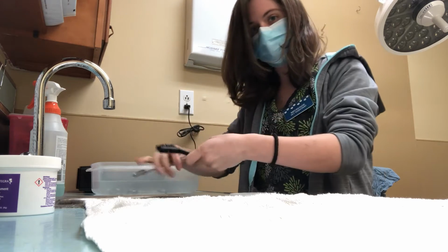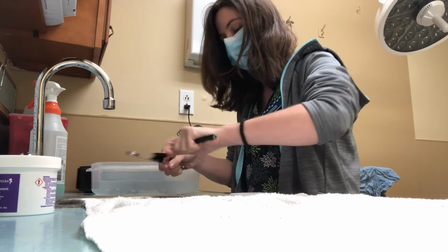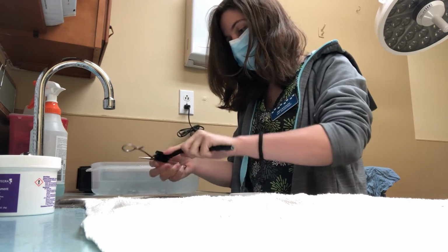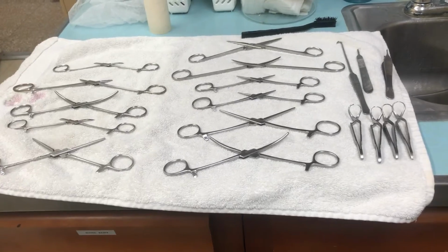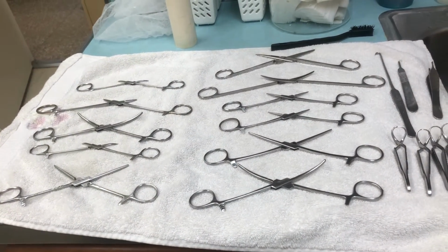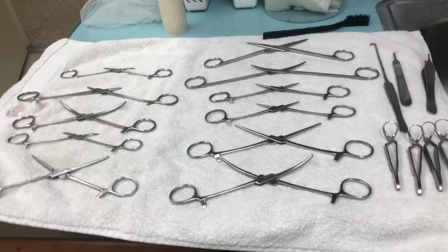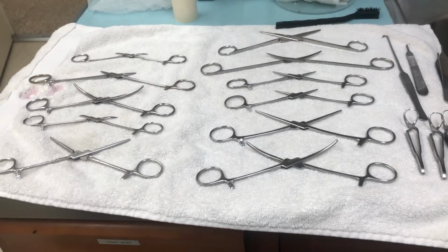So after this, I'll just let them soak for a moment in the distilled water, and then I will take them out and lay them all down again like they were before so that they can dry and be put into their individual surgery packs. So now that I've finished, I can go ahead and let these sit here to dry, and once they're dry, we're going to put them in a pack for the spay pack, and then they are going to be put into an autoclave to be sterilized.